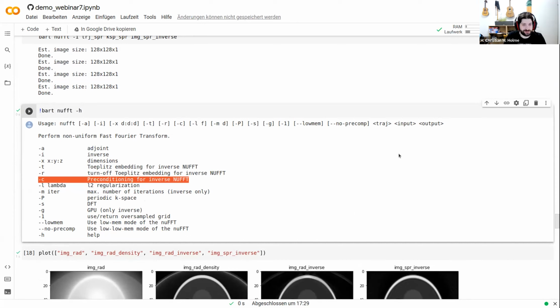Yeah. There's a link by Martin to a paper on density estimation, and Tobias Wood has a 3D non-Cartesian tool called Riesling that can also be good for doing these very large scale problems.